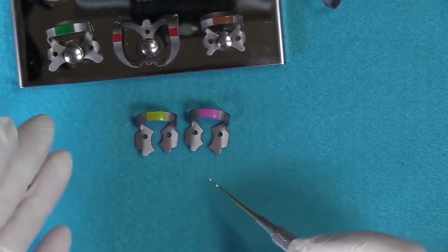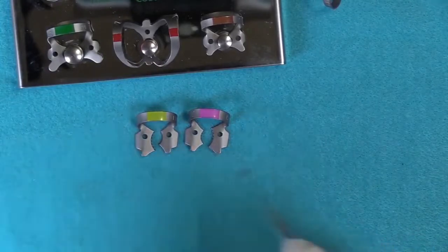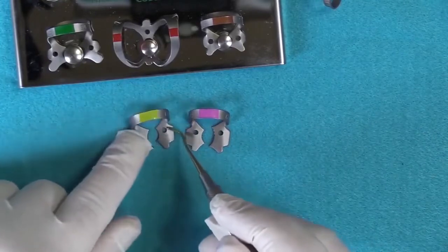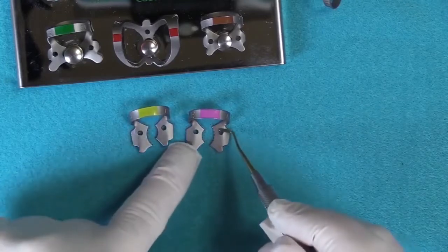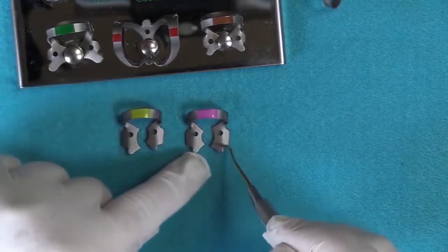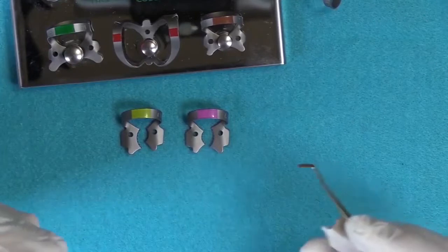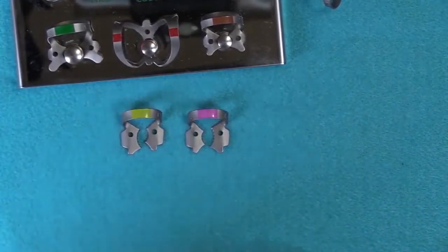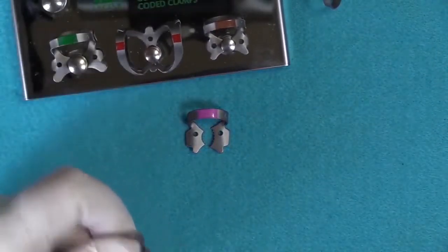So an easy way to remember when you get a clamp that has offset jaws like this, think of BB, big buccal. Therefore, this clamp would be on your lower right, upper left, and vice versa for this one. So again, even though the jaws are flat, if I'm faced with a structurally compromised tooth, even if it's in the upper arch, I'll use this style clamp because I know it's going to stay, essentially because of the serrations.